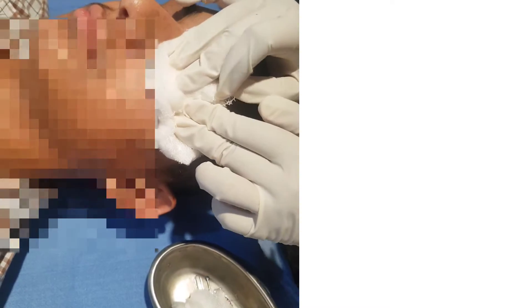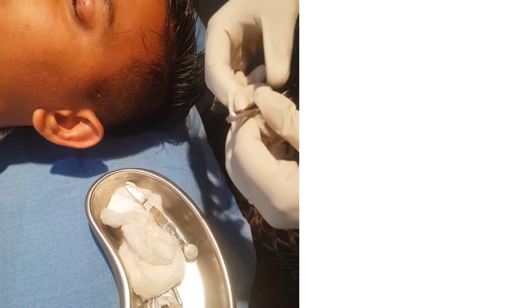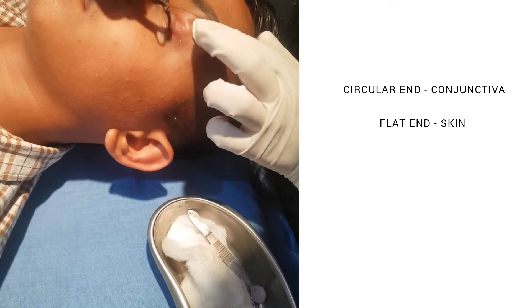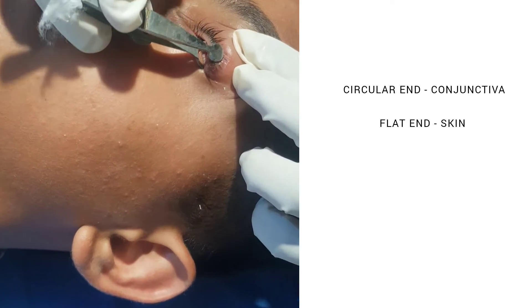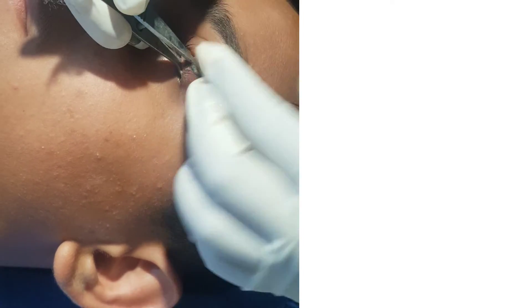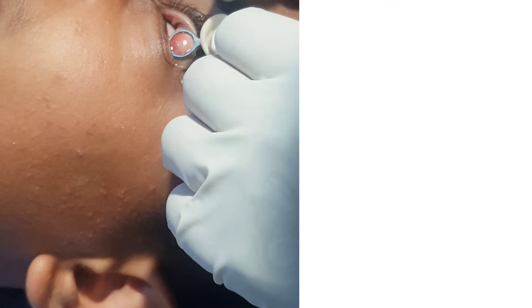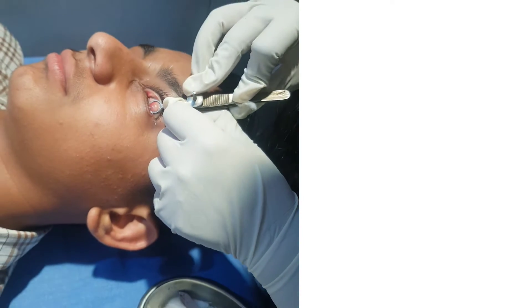After adequate anesthesia is achieved, you take a chalazion clamp, loosen its screw and insert it in such a way that the circular end is on the conjunctival side and the flat end is on the skin side. Then we close the clamp to catch the chalazion, evert the lid and tighten the screw to hold the clamp in its place and also to minimize bleeding.